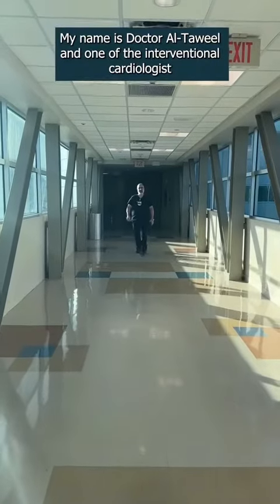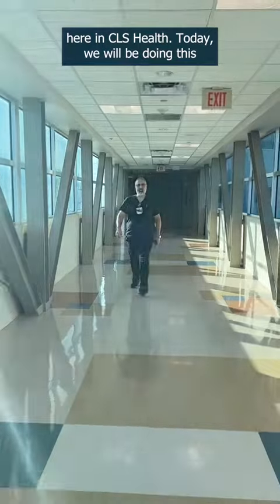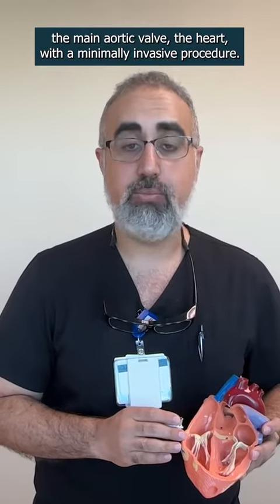My name is Dr. Al-Taweel. I'm one of the interventional cardiologists here at CLS Health. Today we will be doing this procedure called TAVR, Transcatheter Aortic Valve Replacement, where we replace the main aortic valve of the heart with a minimally invasive procedure.